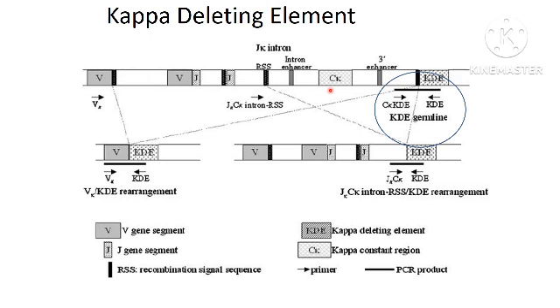So when you have VK and JK, when you have this kappa light chain on the B cell, when the B cell wants to express kappa light chain, you get VJ recombination. So you get VK JK as we have seen in the earlier picture. Suppose that the kappa light chain is giving some non-productive rearrangement. It is not leading to a functional protein, so the cell will not express IG kappa.